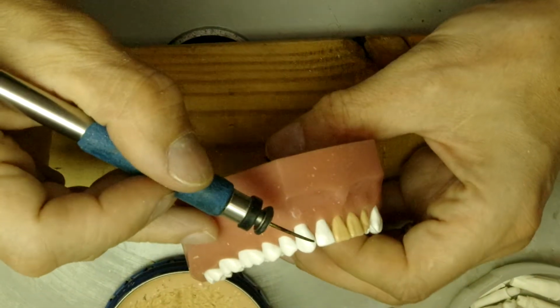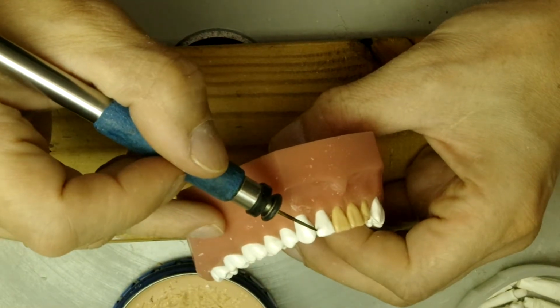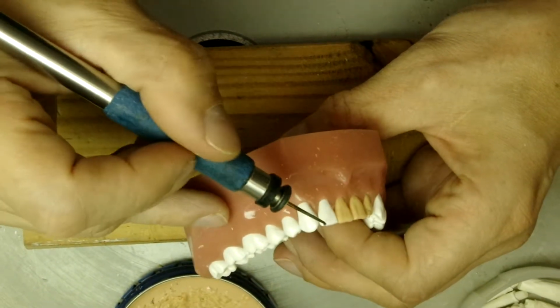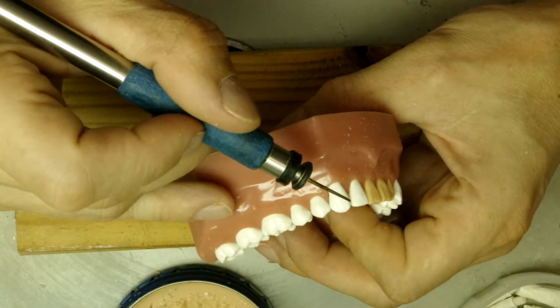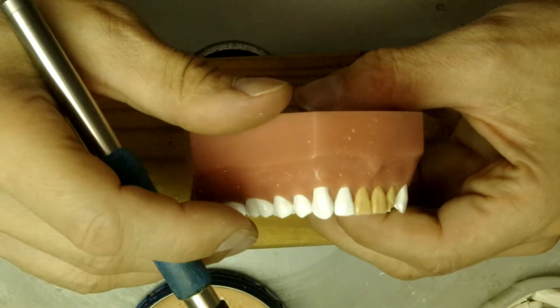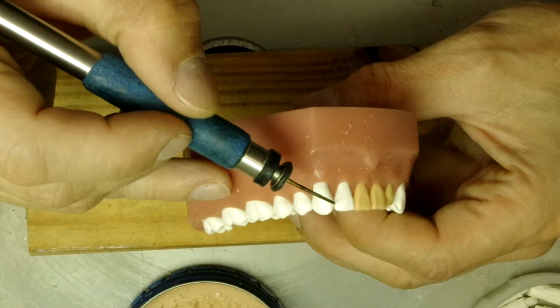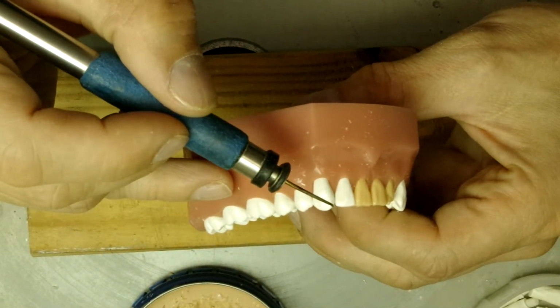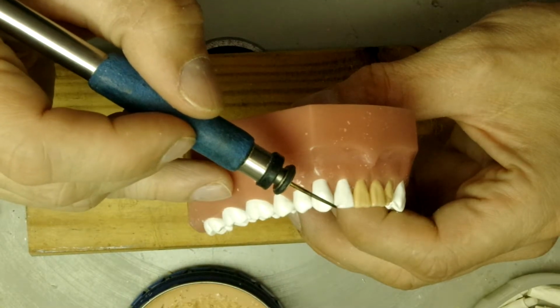If you notice it right here, they have a bigger curve on the distal. The distal point angle is slightly higher than the point angle on the canine. You see the point angle of the canine is right about there. The point angle on the lateral is right about there.